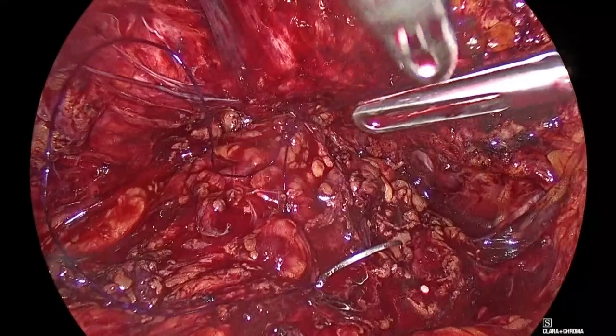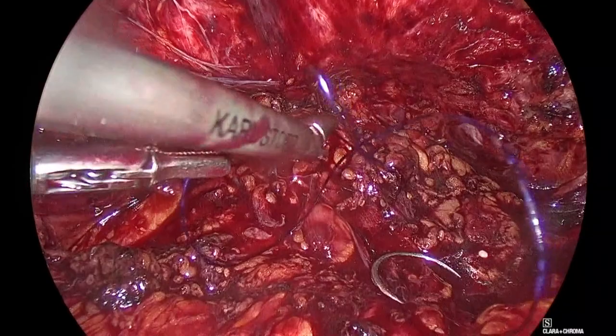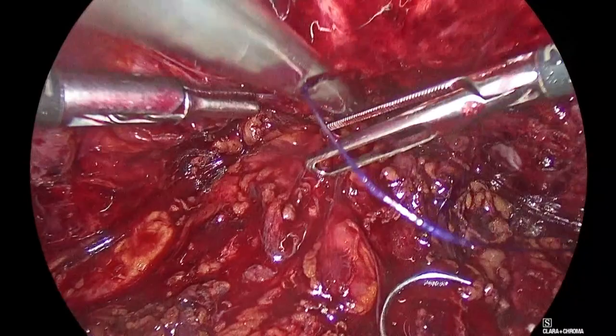Show me. Do you still use a drain in these cases? Always. I don't see why I shouldn't use a drain in any case. I'm a fan of drains. Yeah, there's a big debate on this. A randomized trial recently showed no difference. Come close, Padeli. I know.